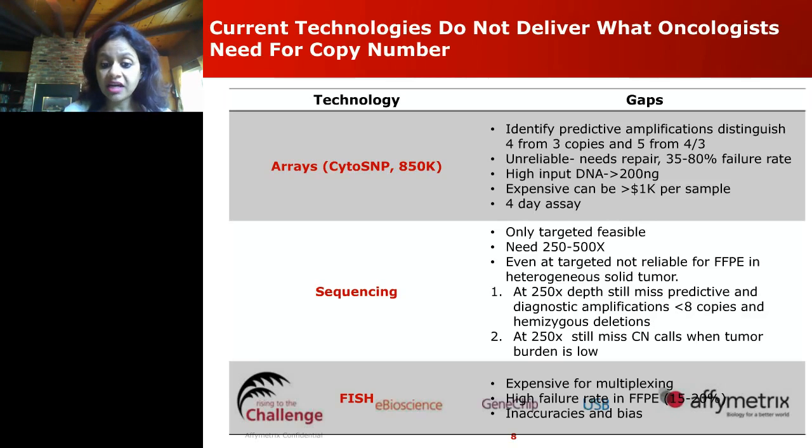They are unreliable, so several of these assays require DNA restoration as a first step. But even after that, the quality of the data can be unreliable. And unfortunately, there are no QC steps that can tell you ahead of time whether the end product is going to be noisy or usable. Which means that until you have consumed the entire precious sample and spent the money and labor on the entire assay, there is an element of risk in terms of whether you're going to get good quality data at the back end.